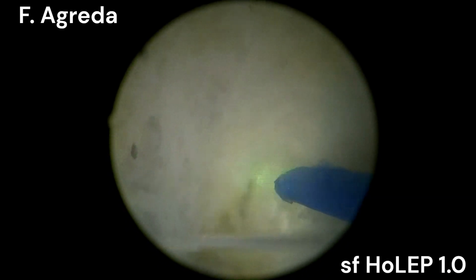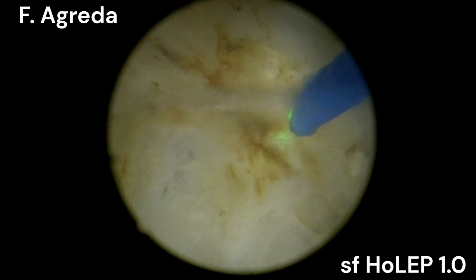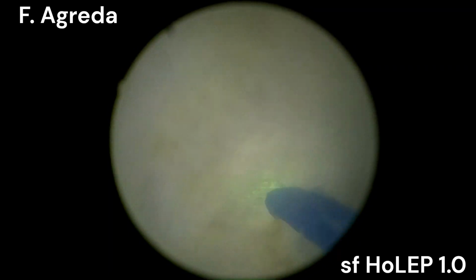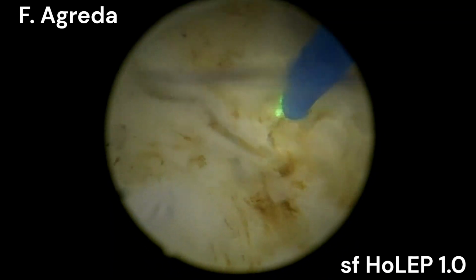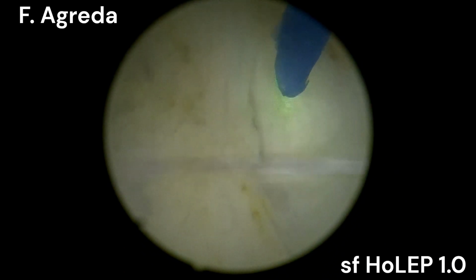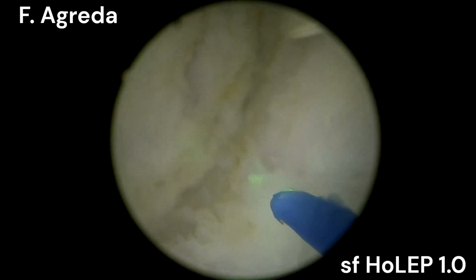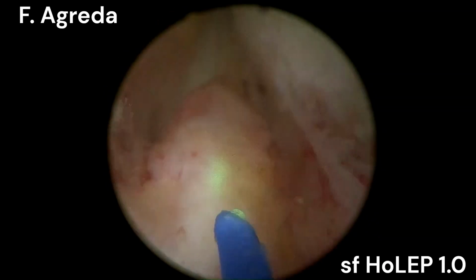So you can see here I'm using the laser beam to almost whiten any kind of attachment of the adenoma to the prostate capsule in a very progressive, very slow, I wouldn't say slow, I would say controlled manner. There's almost no bleeding there because I'm using the laser as it's supposed to be used. Almost no blunt dissection, but it would be kind of nonsense. The only use of the scope is to locate the plane.